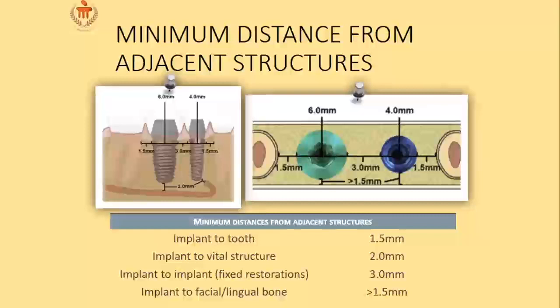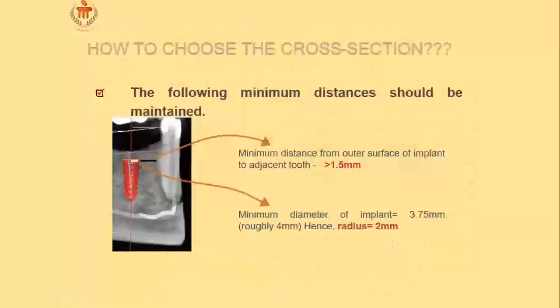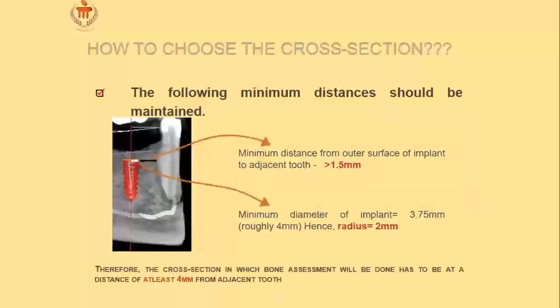If you don't have all this free space available, trust me, there's no way you can place the implant. So these guidelines are important, okay? And then, that's what we said, the minimum distances should always be maintained. Then you can choose your implant.